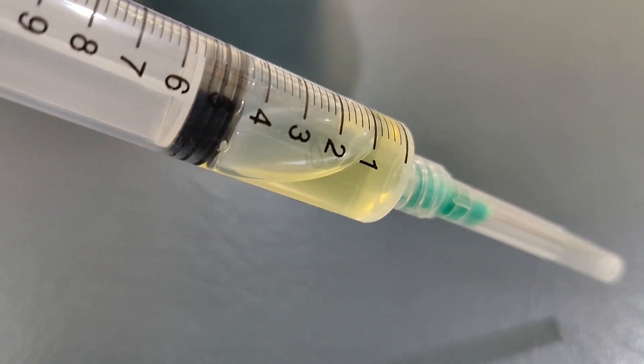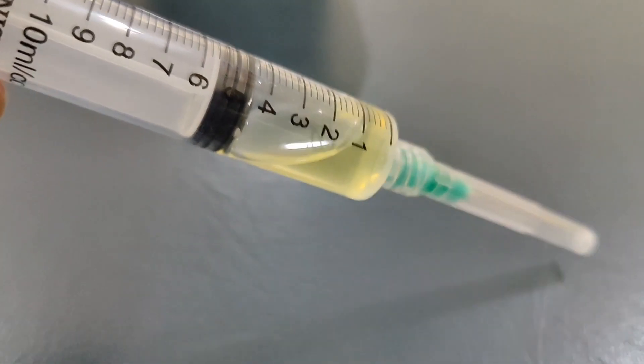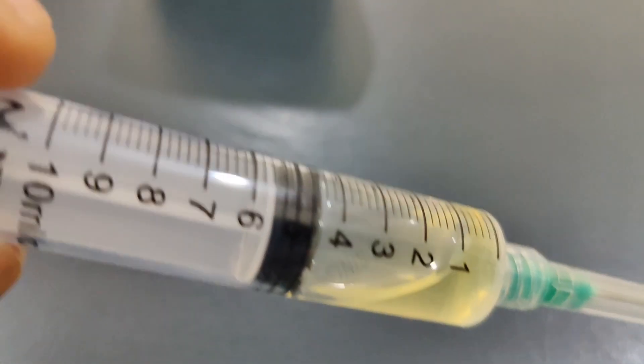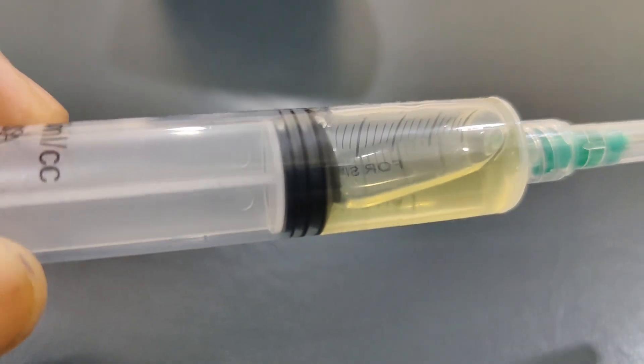Inside the balloon is a thick, slippery fluid similar to the fluid that lubricates your joint. You can see it in this syringe.